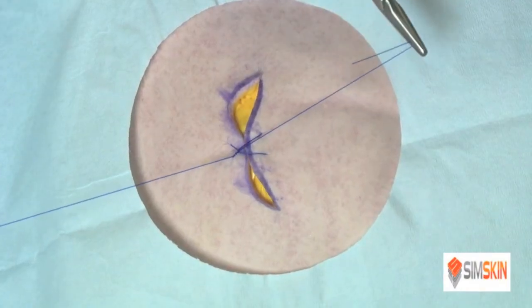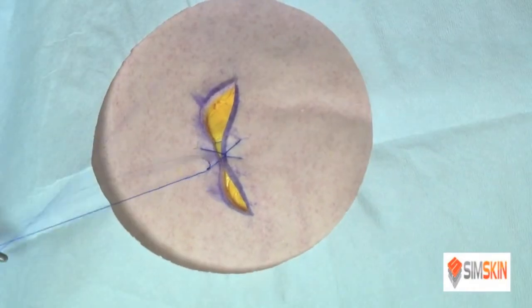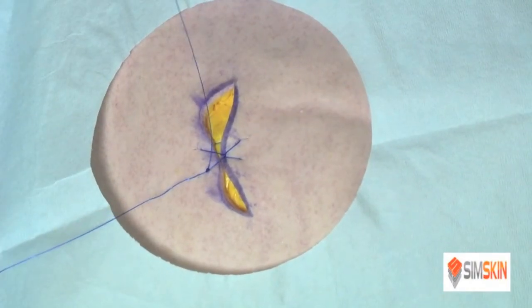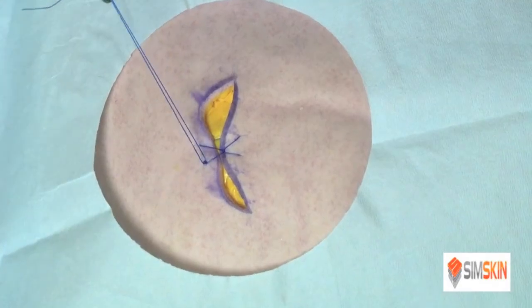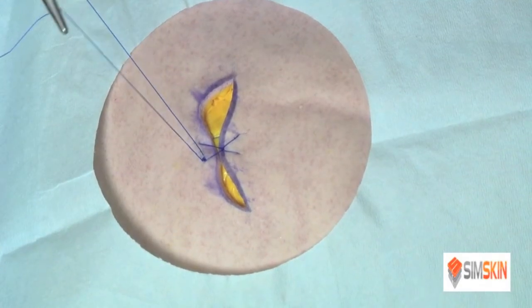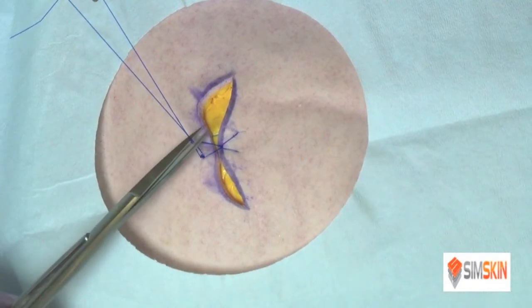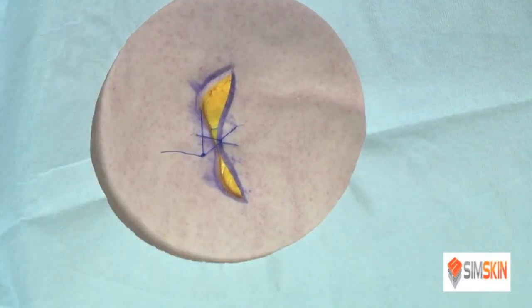That's really clever. Now, it looks like you've taken a healthy bite from both wound edges. That's really a key feature of this closure - you want to take those healthy bites so you don't tear the tissue when you close it under tension.